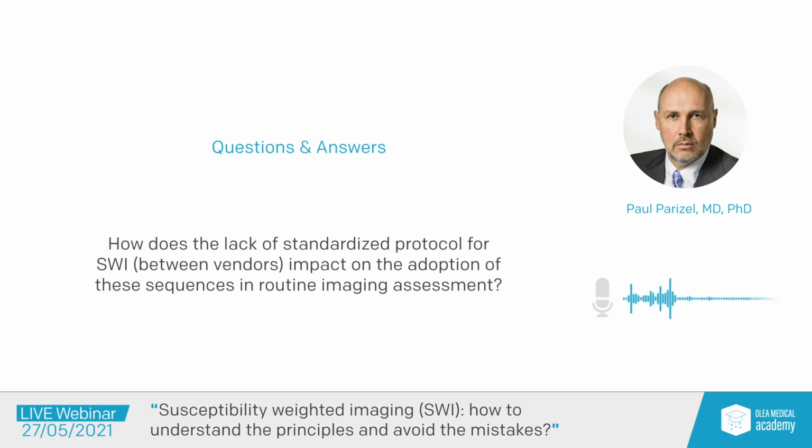But it is a big problem. You know that we are moving in magnetic resonance imaging towards quantitative imaging. For example, in a patient with traumatic brain injury, you would like to have a number for the lesion load in terms of the number of hemorrhages. It is very difficult to compare a Siemens with a Philips, with a GE, with a Toshiba, with whatever vendor image. So as long as you stay within the same vendor, within the same field strength, and with the same sequence, there is no issue. But if you do examine patients over a platform of different scanners, then you have a problem. And I guess the only way around that is, if you plan to do longitudinal or comparative studies, that you would always plan to examine your patients on the same equipment with the same sequence.